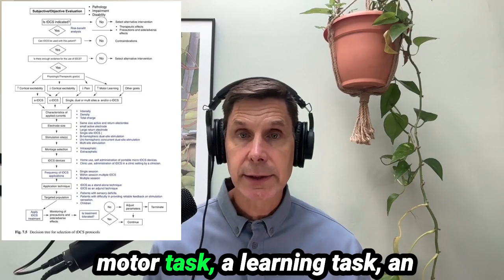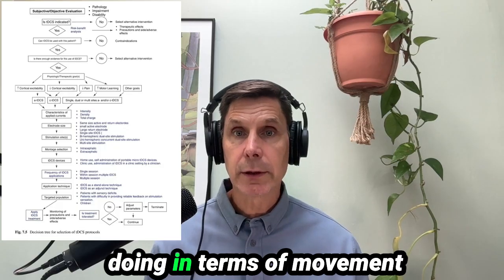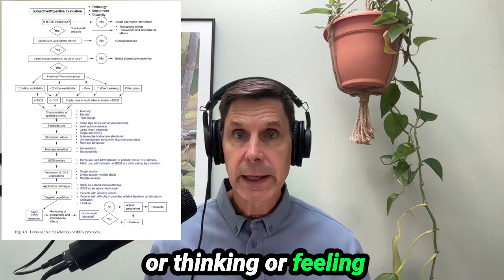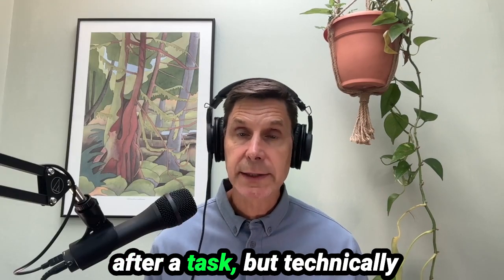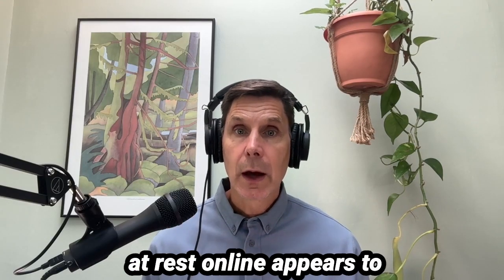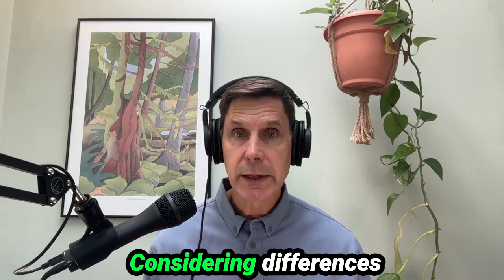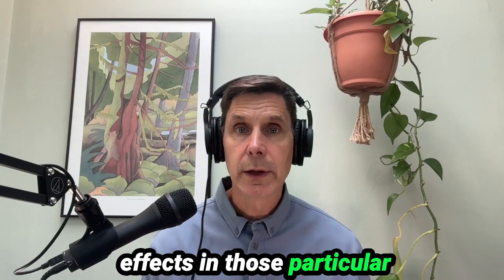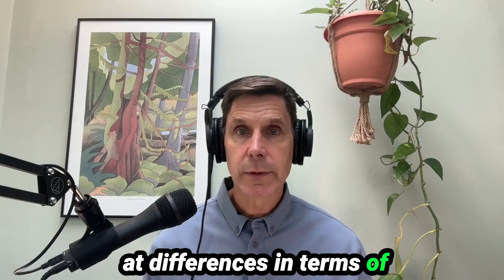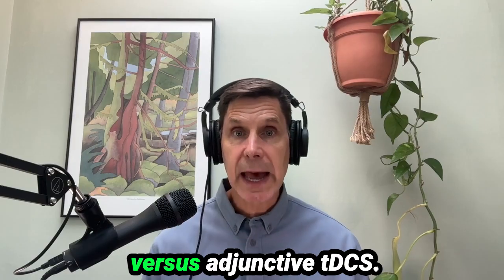The fourth is timing. So online during a task, like a motor task, a learning task, an emotional task, or some other sort of activity that a person's doing in terms of movement or thinking or feeling, versus offline, which would be before or after a task. So stimulation before or after a task, but technically at rest. Online appears to yield stronger behavioral effects in those particular studies that are looking at differences in terms of online versus offline effects. Now let's have a look at standalone tDCS versus adjunctive tDCS.